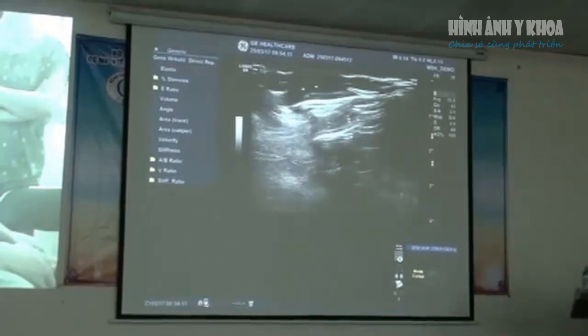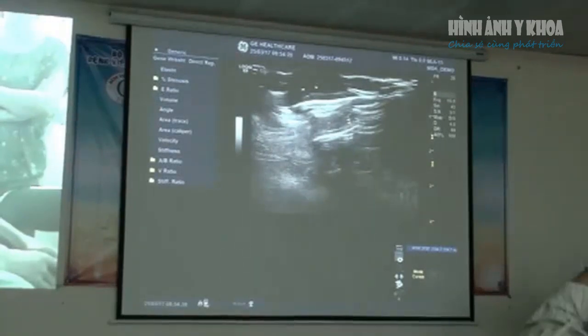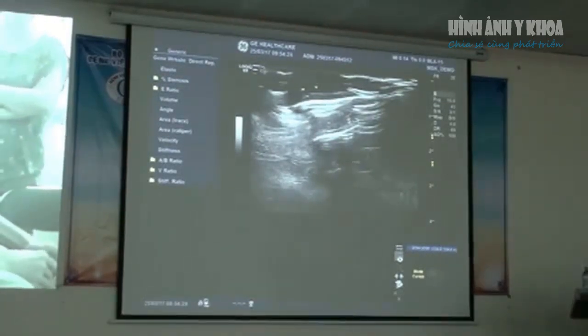So ultrasound is very good at saying something is there, yes, no, but in terms of general things, it's less accurate. So the more directed the ultrasound examination, the better.